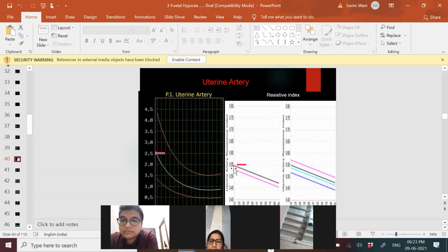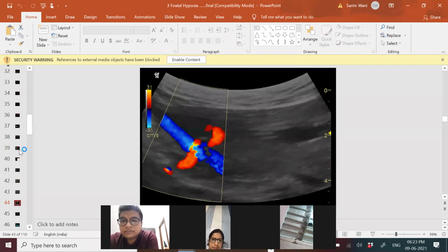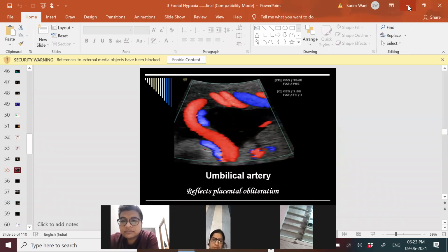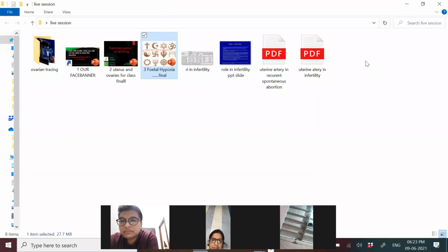In infertile patients, yes, sir. Infertile patient resistance will be high. Very good. Now, wait. Now the point is, how much is the normal? Okay. So we will not discuss how the uterine artery looks in the first trimester or second trimester. This is all in the course. We will discuss the question here. I am sorry for these questions. I give very long explanations because I don't believe in giving one-line answers.